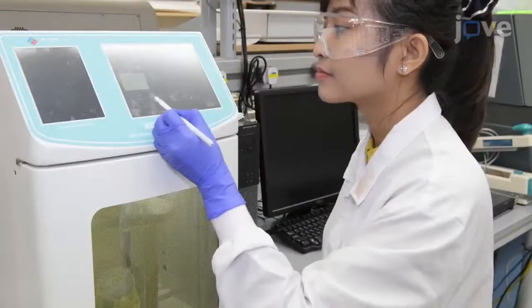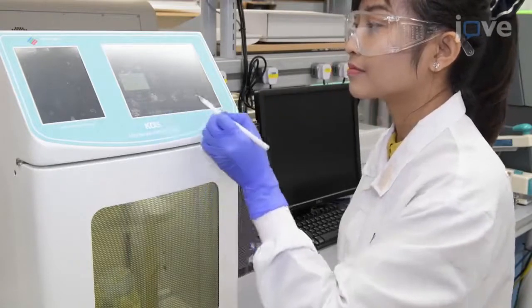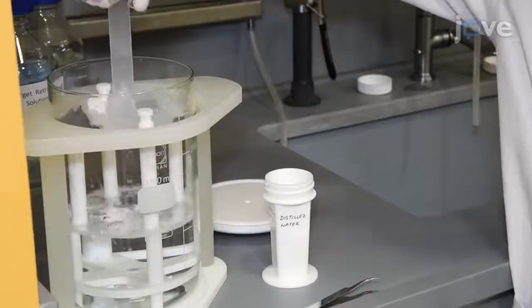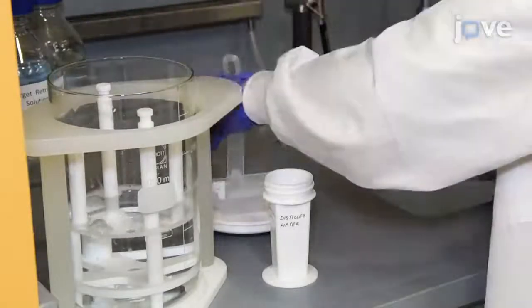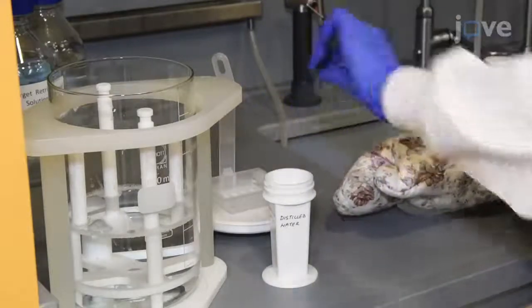For example, the fourth antibody requires three additional rounds of microwave stripping prior to staining. After completion of the stripping process, use forceps and heat-proof gloves to transfer the slides to distilled water at room temperature for an at least 10-minute cool-down.